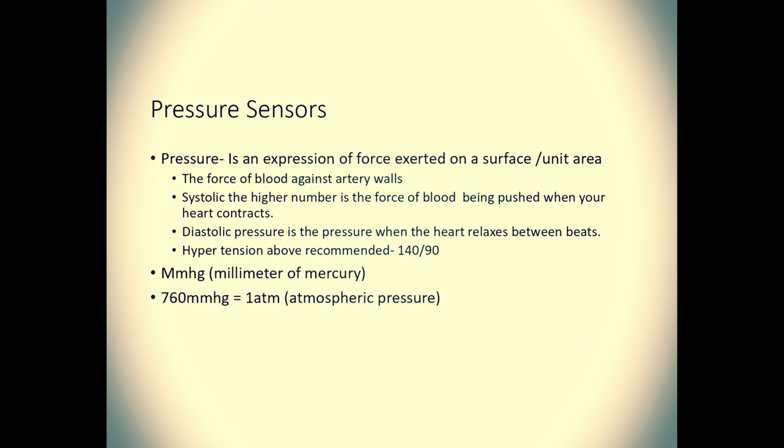Pressure can be said to be an expression of force put on a surface per unit area. The force applied on a surface. So what sort of pressure are we going to measure?